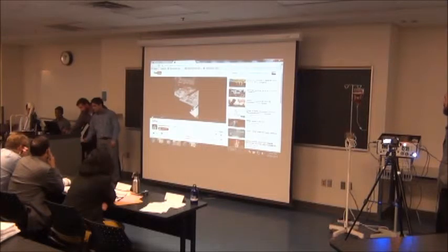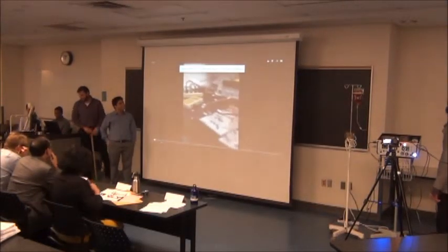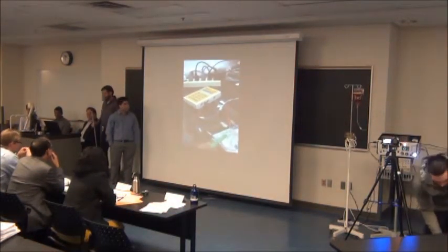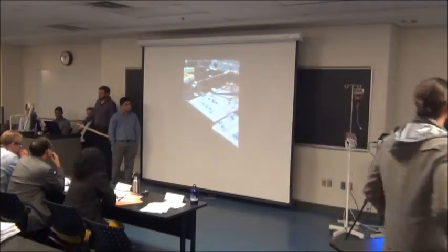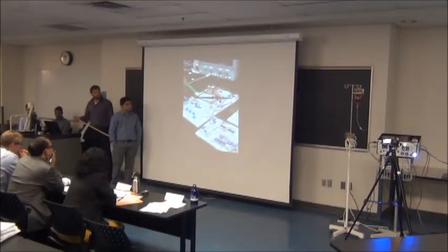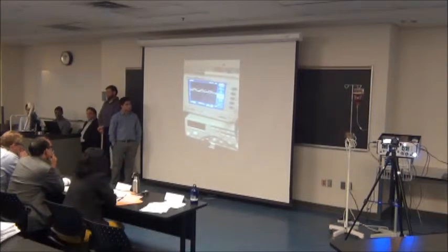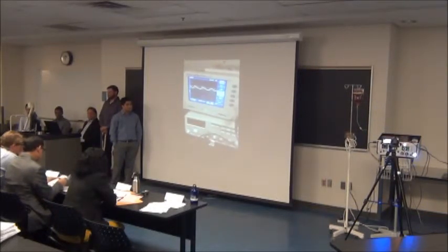Okay, this is take 2 of our temperamental beats per minute circuit. So if you can show the audience, there's the simulator right there. And so the signal is coming into the acquisition circuit. And then it's going through to the auto 0 circuit. So the waveform we've got right now is just our standard 120 over 80, and it's doing quite nicely.